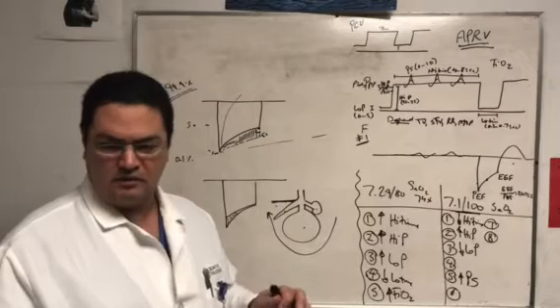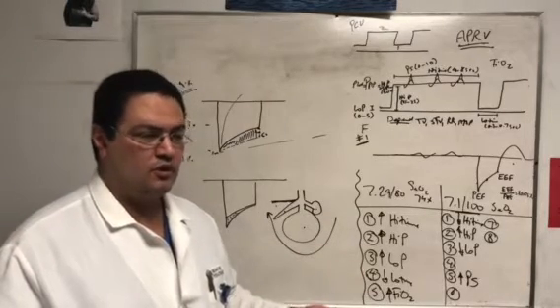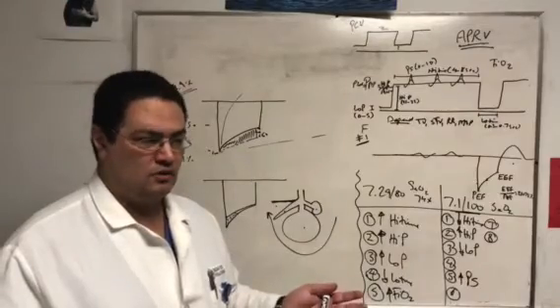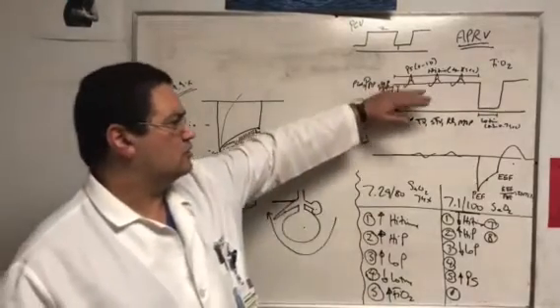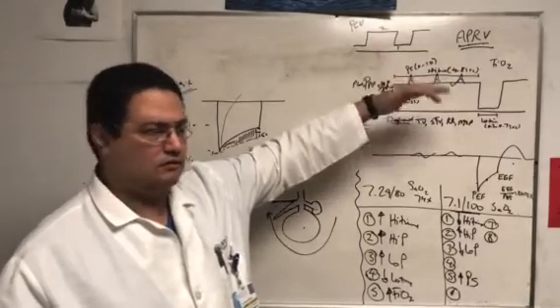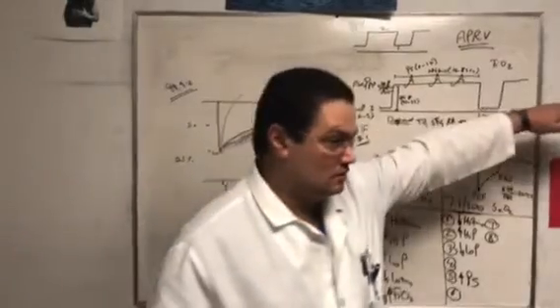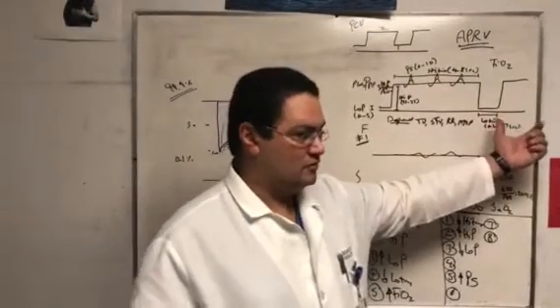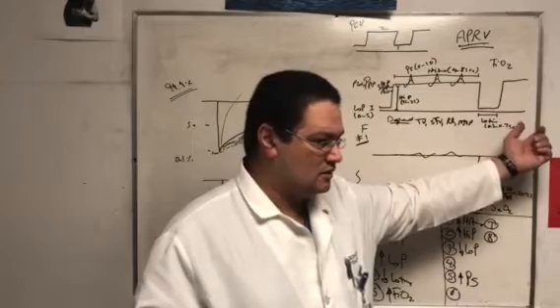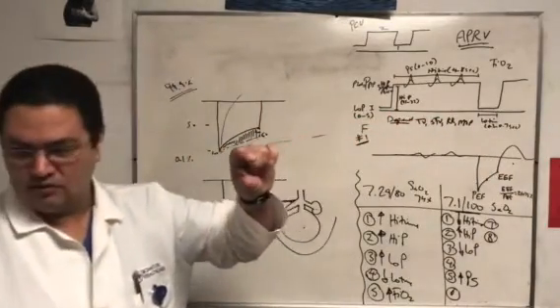There are only a few circumstances where we should increase the pressure support, which is when we wean the patient. Let's say the patient is weaning, and the high pressure is going so low now, like 10, 15, let's say 15, for 14 seconds, right? And 5 pressure for 0.5 seconds, right? So what's the difference between 15 and 5?